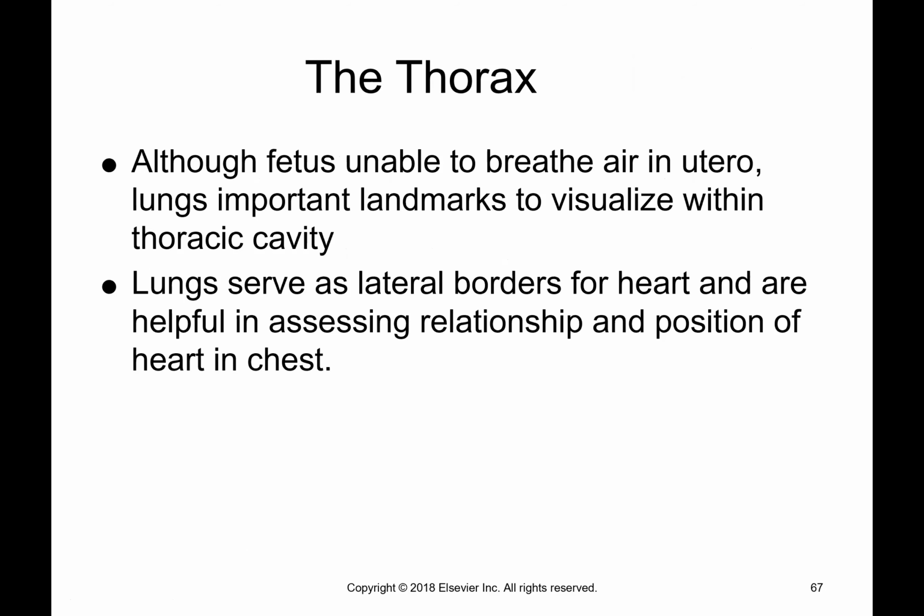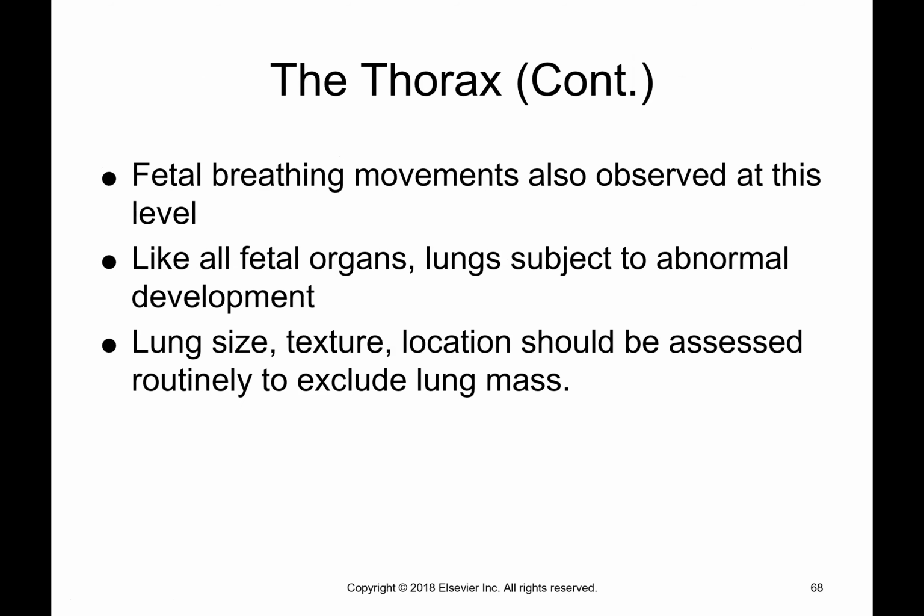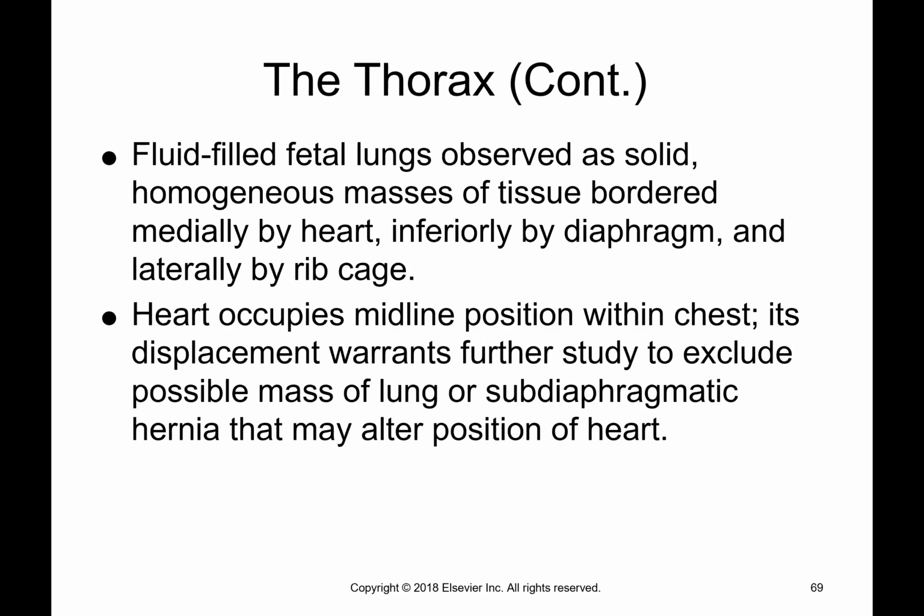All right, so then we get done with the spine, then we'll go to the thorax. We want to see those beautiful lungs that are echogenic and are lateral borders to the heart. We will be looking at fetal breathing movements in lab. We should see that in the third trimester especially. The lungs are such an important part, because the baby can't survive without lung development. So it's really important that we assess the lungs for a lung mass. Again, in the thorax chapter, we'll talk about all the things that could go wrong with lungs.